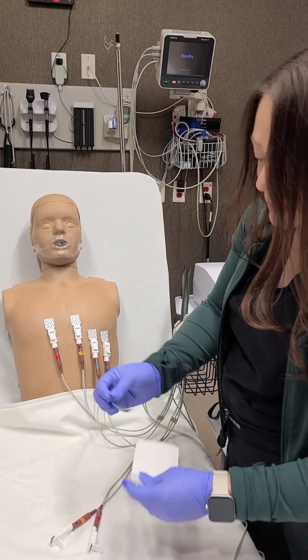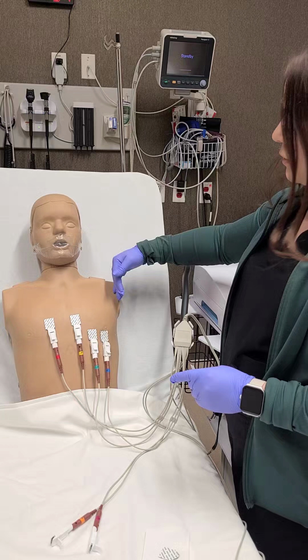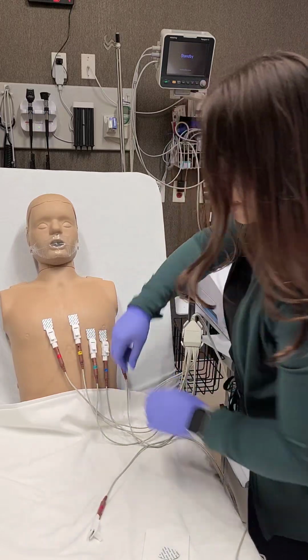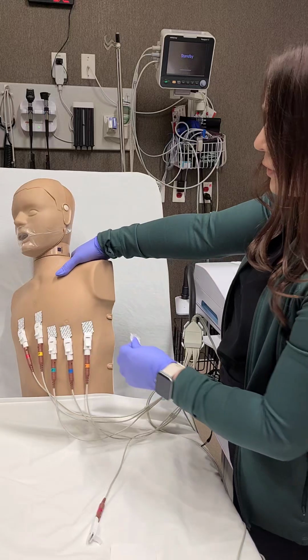Next, V5 is in the fifth intercostal space, anterior axillary line. So if you have your anterior axillary line, come all the way down over here to that fifth intercostal space. And last is your V6. V6 is mid-axillary line, fifth intercostal space.